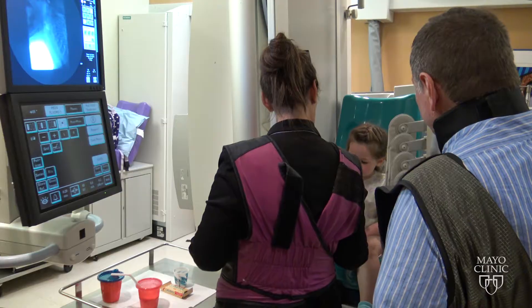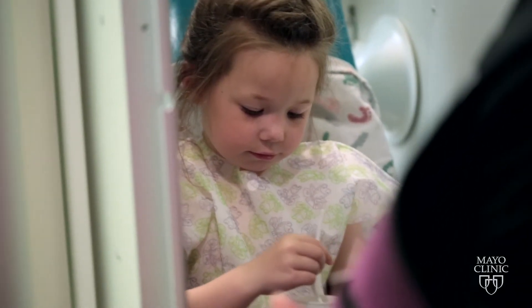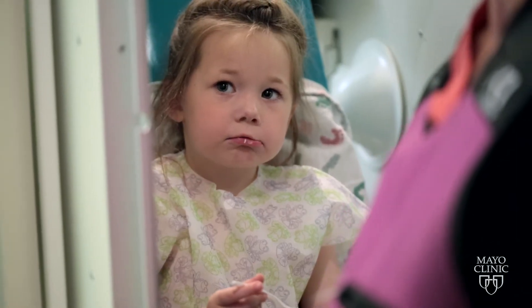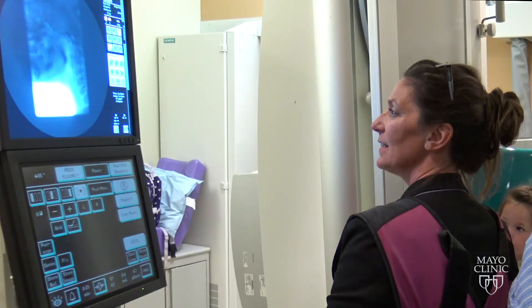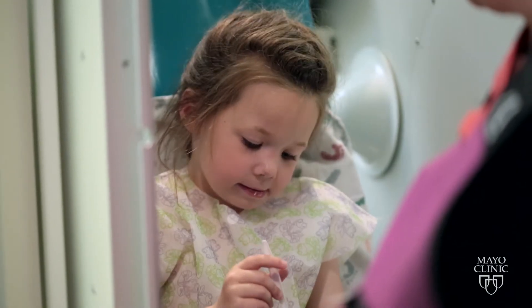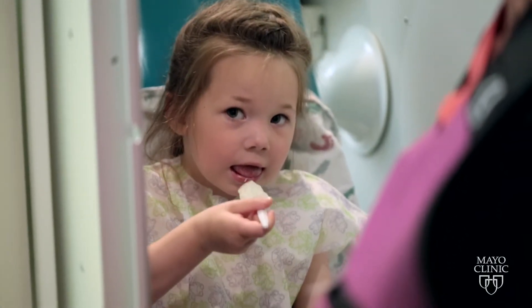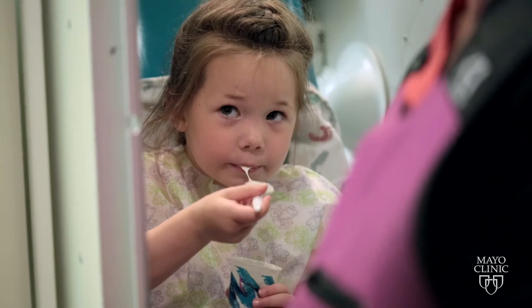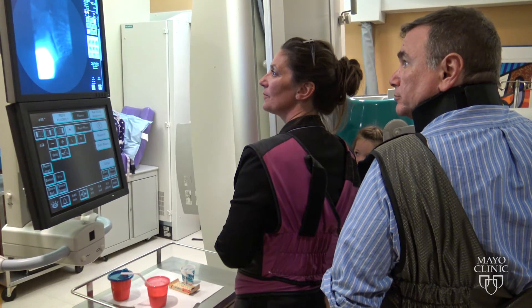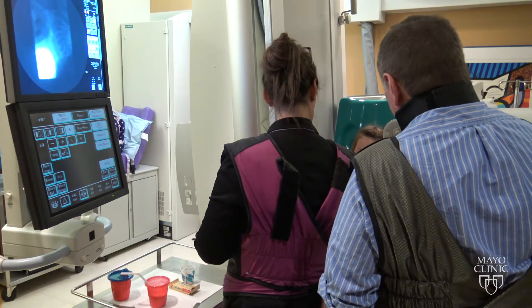I'm going to get the applesauce. Do you want to do this? Do you want to hold it? Very nice. Can you do one more of those for me? Very good. Nice work, Scarlett.